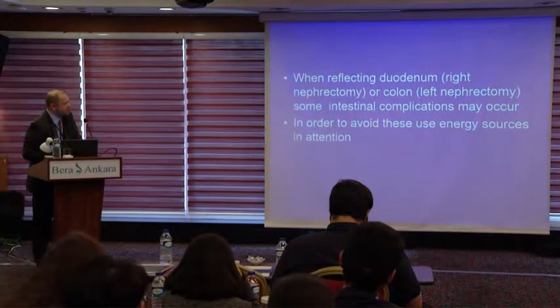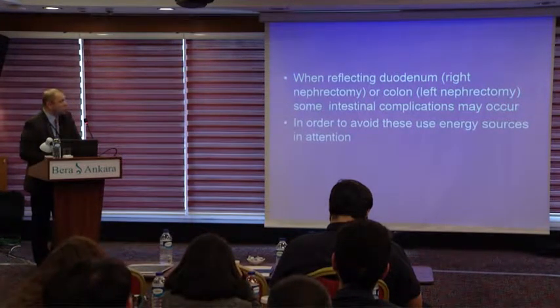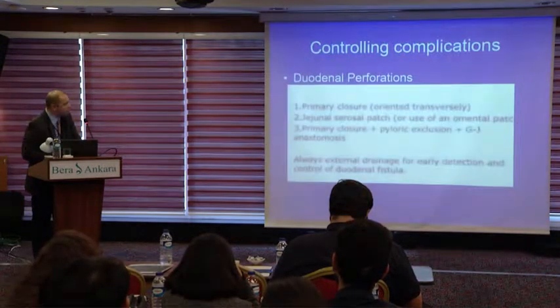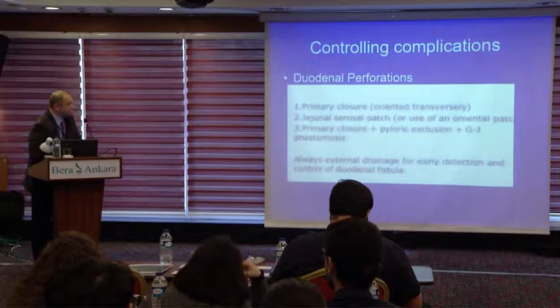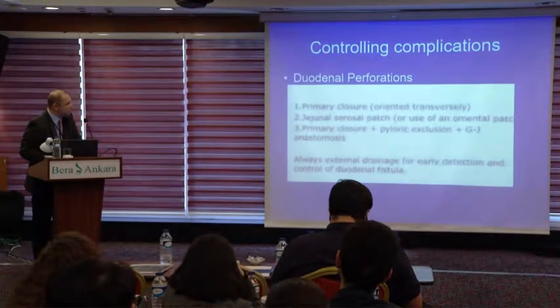When reflecting these intestinal segments, some intestinal complications may occur. In order to avoid these, energy sources must be used with attention. Of course, some ways exist in order to control these complications, but in order to decrease the morbidity, you have to be very careful.